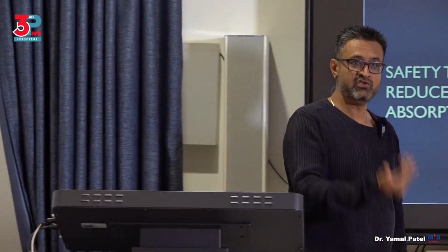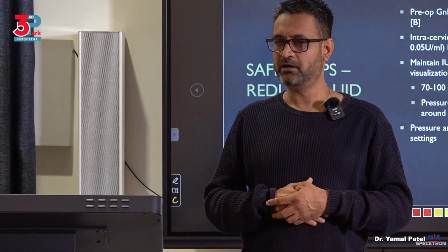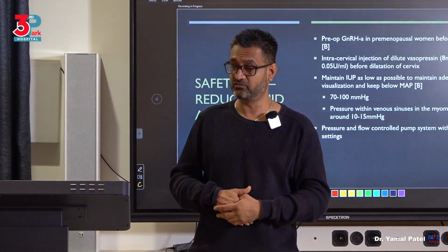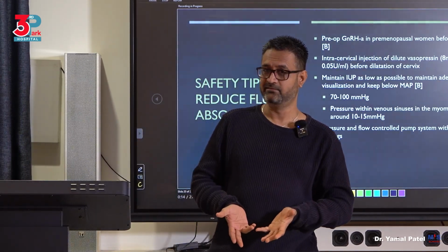So it has no effect. And in a bipolar resectoscope, you use saline. That's why the new resectoscopes are all bipolar, because you don't need to worry about using the non-electrolyte solution and getting the complications with that. Use a bipolar resectoscope with saline. You've understood?